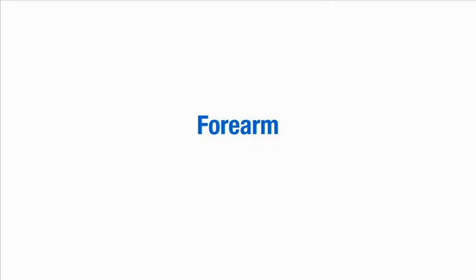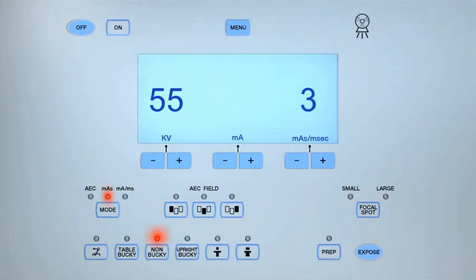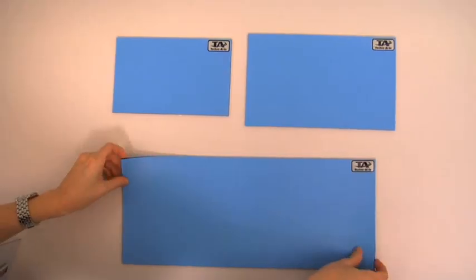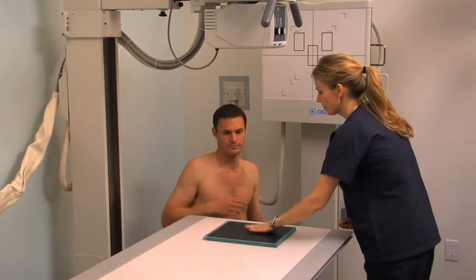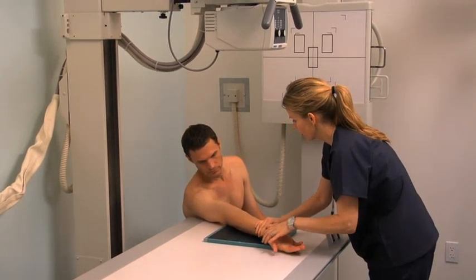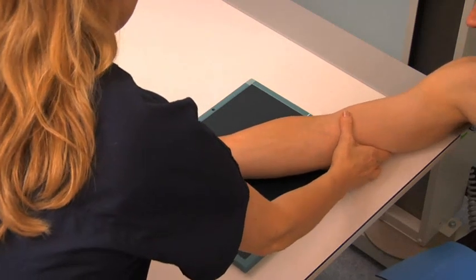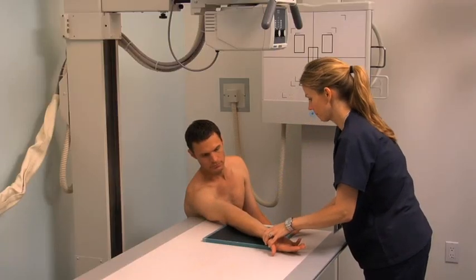To obtain a radiograph of the forearm in the AP projection, place a 14-by-17-inch cassette on the tabletop. Set the SID to 40 inches, select the non-bucky setting and the small focal spot. Set the exposure parameters to between 55 and 60 kV and 3 and 4 MAS. Ask the patient to sit alongside the end of the table and position a protective shield over their reproductive organs. Ask the patient to fully extend their arm on the cassette with the posterior aspect of their humerus and forearm on the table; the patient may have to lean laterally for alignment. Align the forearm with the center of the cassette and palpate the humeral epicondyles to ensure that they are equidistant from the cassette.